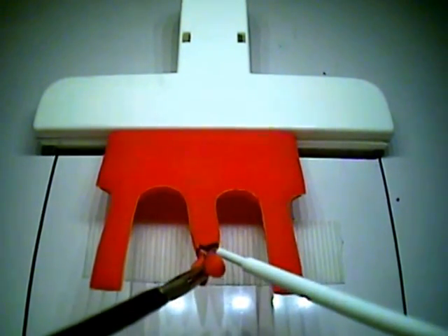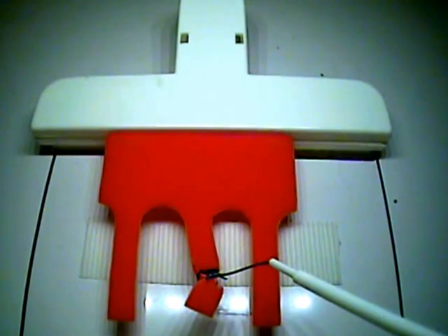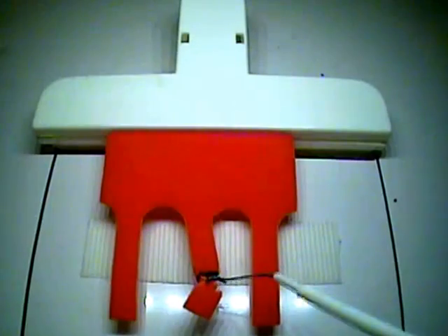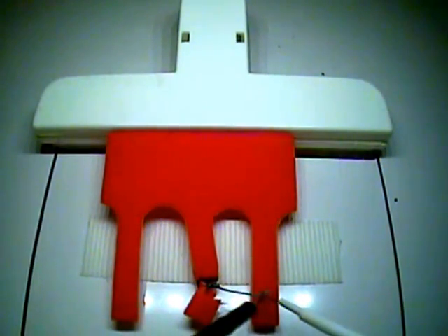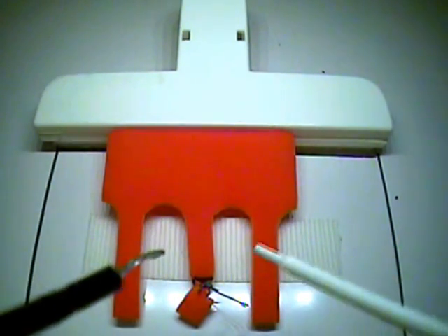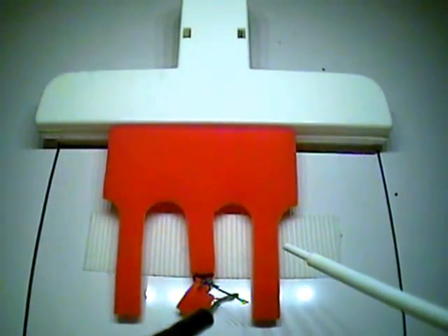At this point, remove your locking grasper, switch to the scissors, and cut the stitch with your non-dominant hand. The exercise is now complete. Time for this exercise starts when your instruments enter the field of view and ends when the stitch is cut. The average time for this exercise is 53 seconds.